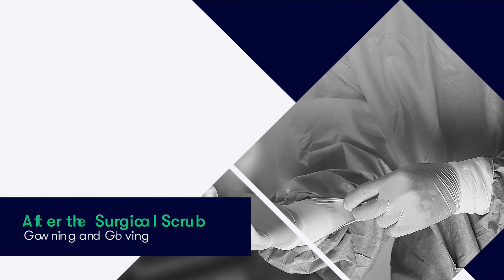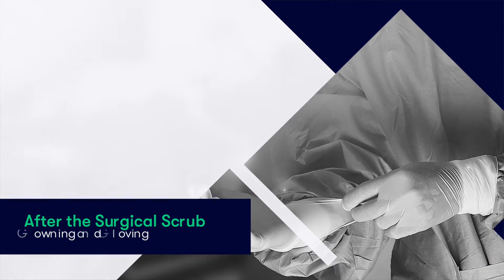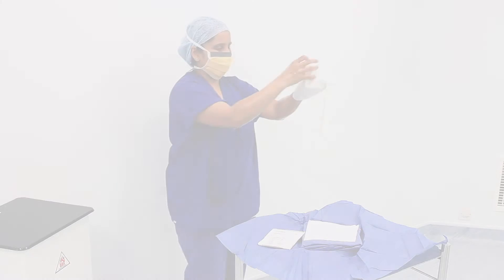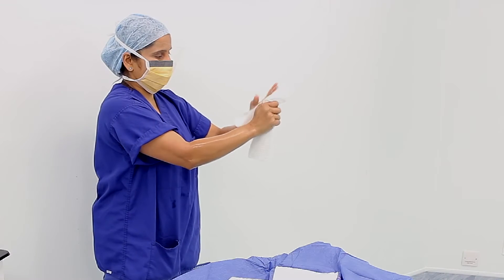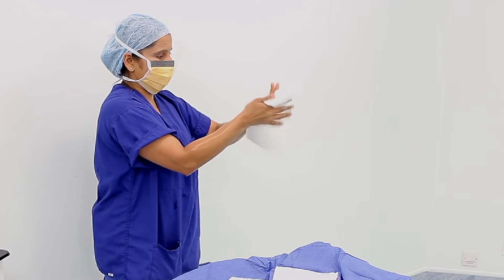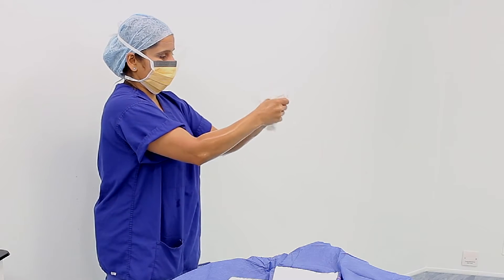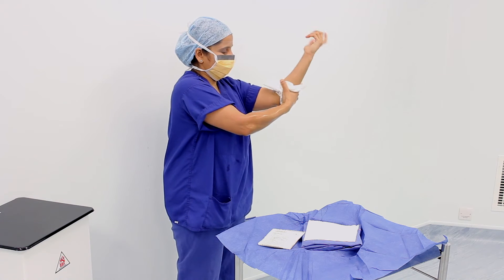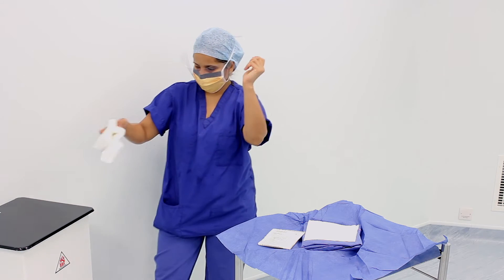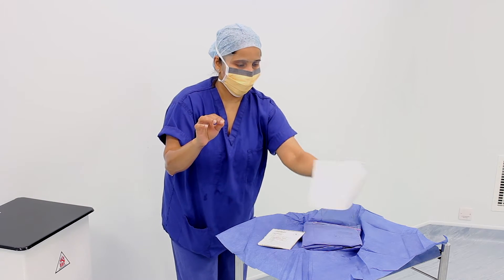We can now proceed to perform the surgical scrub. Having completed our surgical scrub, we then dry our hands and forearms using the sterile sheets provided in the same pack that contains the gown. We pick up one towel and use it to dry one hand — in this case the left hand. We start by drying each of the fingers, then the palm and dorsum of the hand, before drying down the forearm. We then dispose of that drying sheet before picking up the other and repeating the process for the other hand.